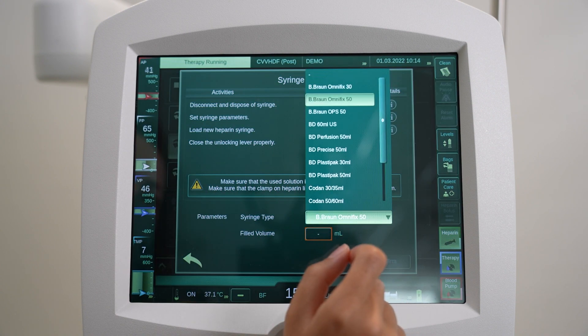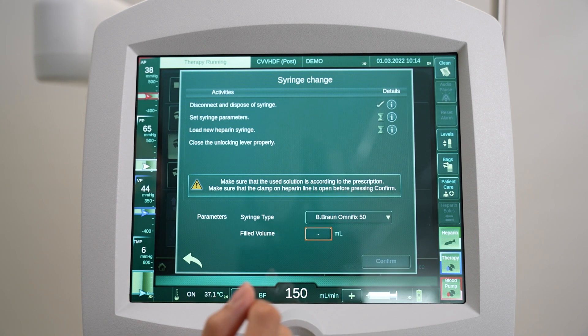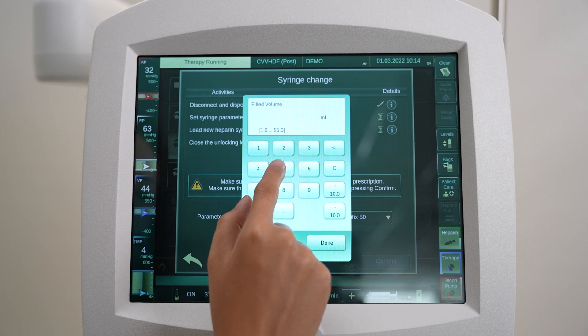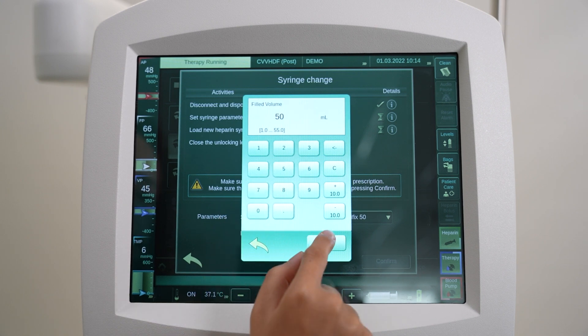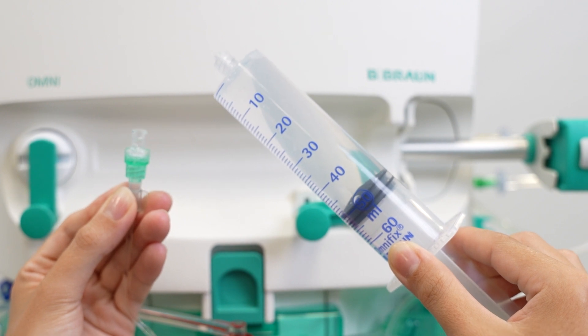On the syringe change screen, press the Syringe Type drop-down field and select the syringe type with the correct size that you want to use. Press the Filled Volume field and enter the volume of the solution in the syringe. Load the new heparin syringe.